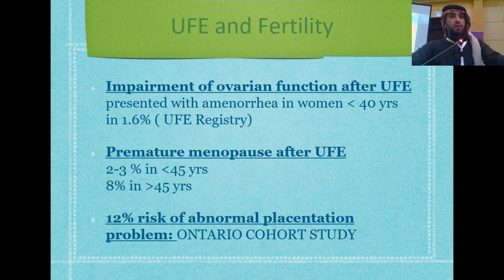In the old literature, you know, fibroid embolization has been on the market for more than 29 years. The first case was done in France in 1988 by Ravina, by chance. Now there are plenty of respected articles in the literature. So this percentage came down over the years. The technique of embolization has significantly improved. The embolics are improved, catheters are improved. We know the classification and the anastomosis between the uterine artery and the ovarian artery.